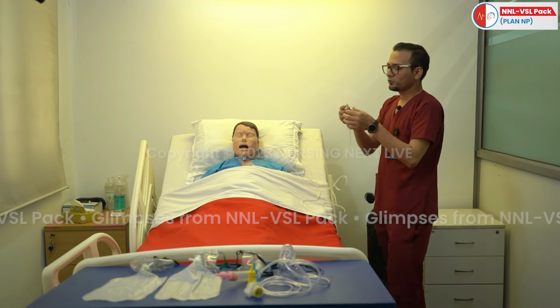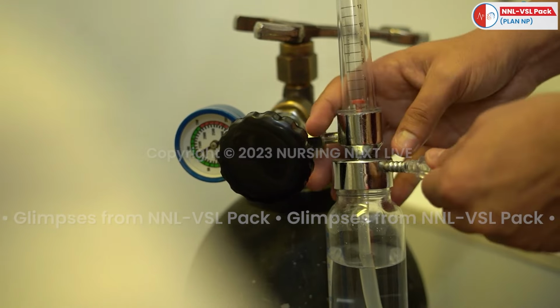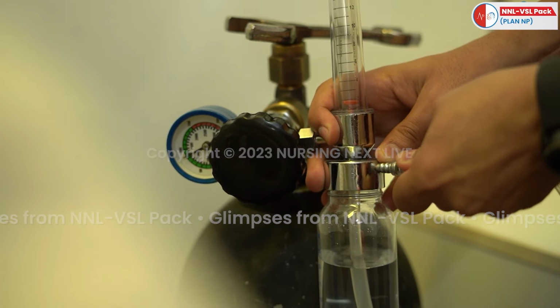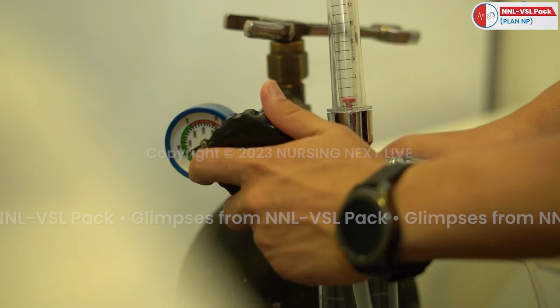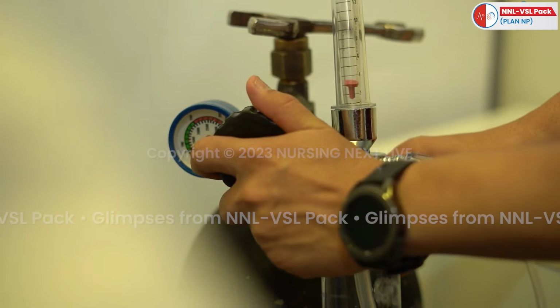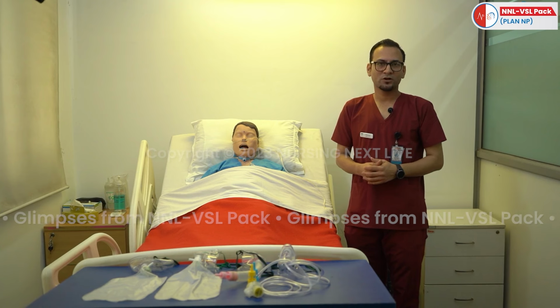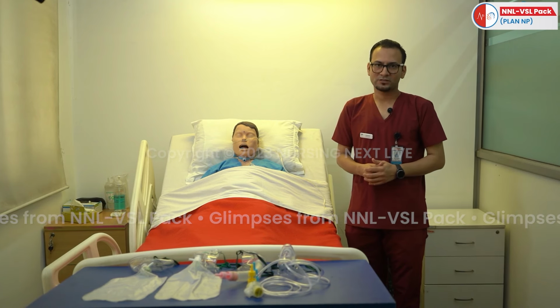And the other end of this port we are going to connect to the oxygen. With the help of this oxygen device, we can deliver 2 to 4 liters of oxygenation. That means that is 24 to 44% oxygenation.